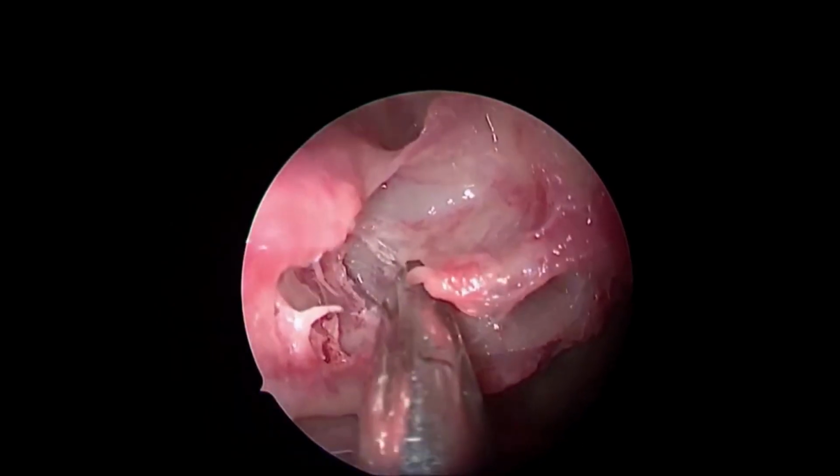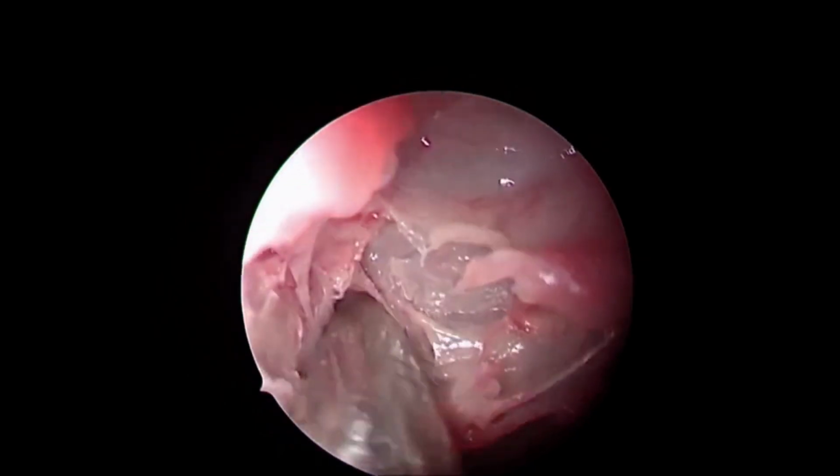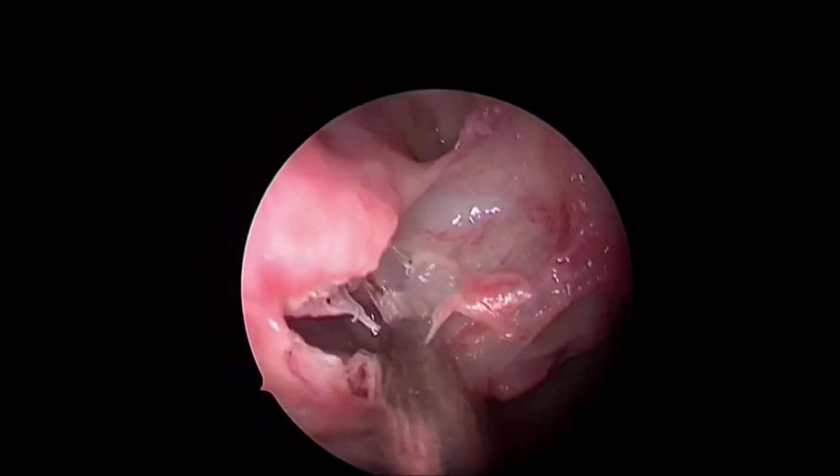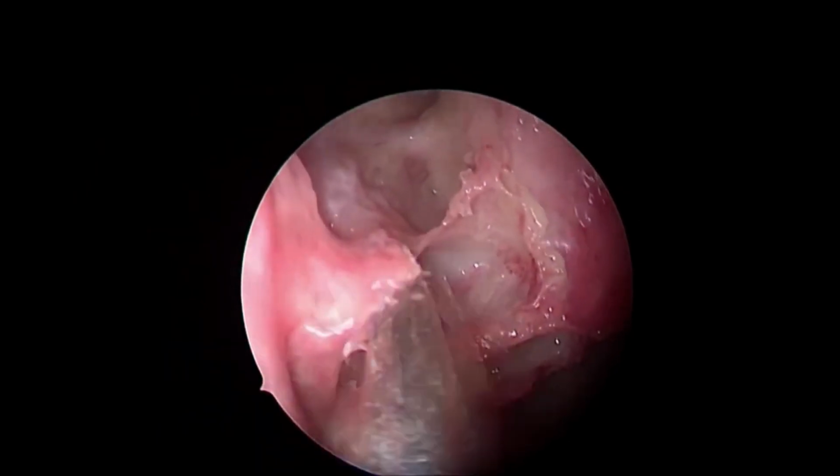I'll tell you the reason. See this? This is the point of entry into the ground lamella, and that is so clear. And as I enter, I stay more and more medially.